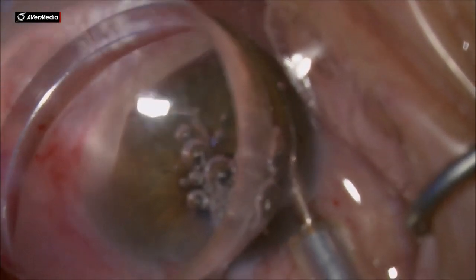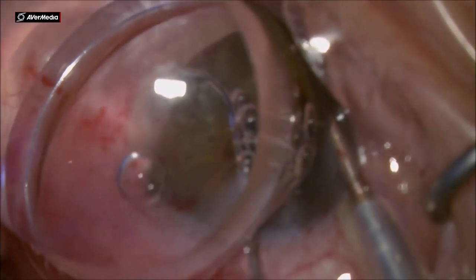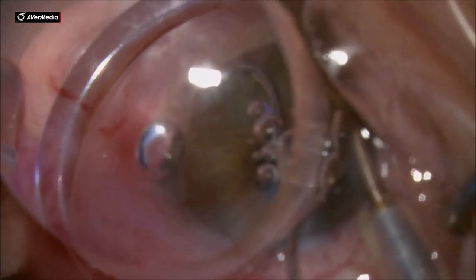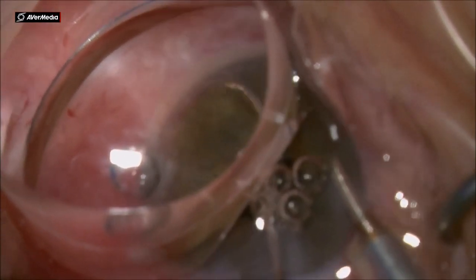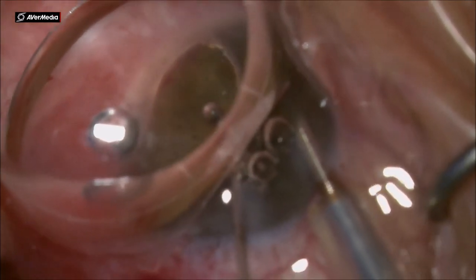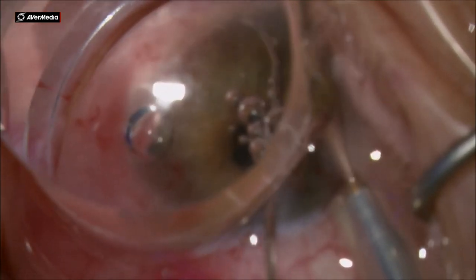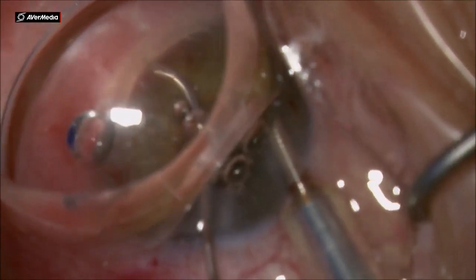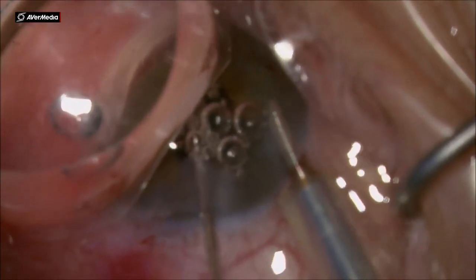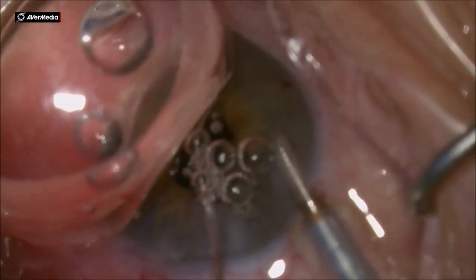Unfortunately, I have some blood coming from the paracentesis that's obstructing my view. I placed viscoelastic but this blood under the gonio lens is obstructing the view and I'm barely seeing the trabecular meshwork. Under the microscope, the image is a little bit better but not great. So I'm trying to push the gonio lens into the area where there is less blood underneath.